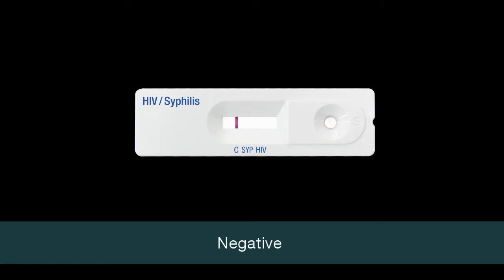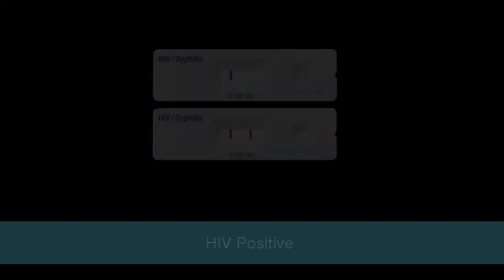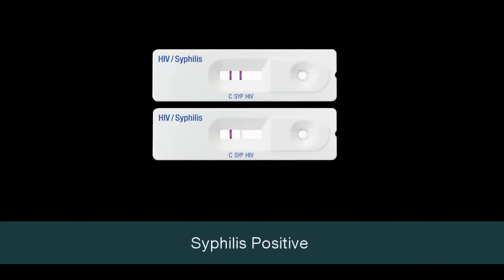Only one line C on the result window means negative. Two lines — control line C and test line HIV — within the result window indicates a positive result for HIV 1 or 2. Two lines — control line C and test line S-SYP — within the result window indicates a positive result for syphilis.